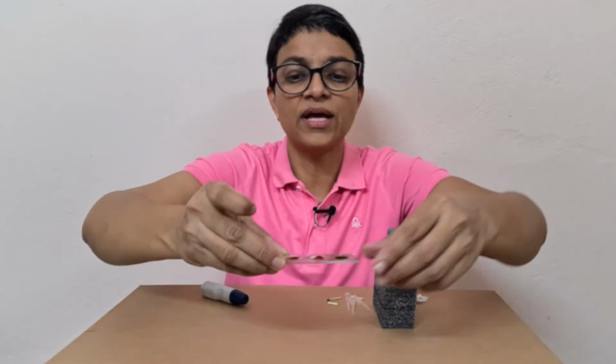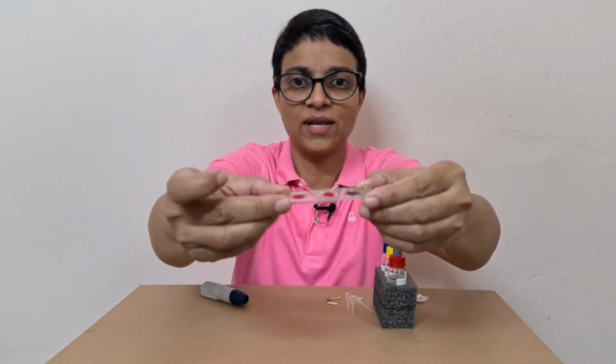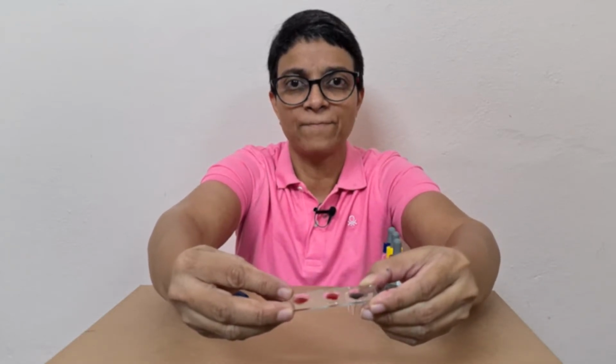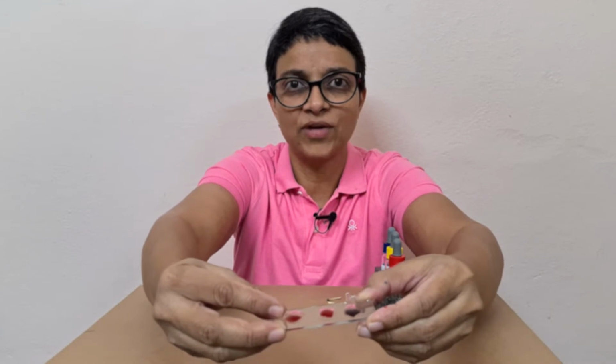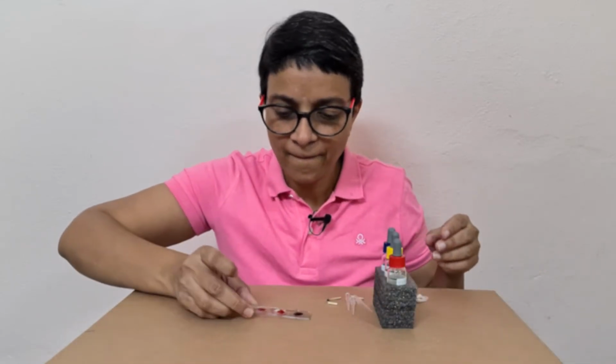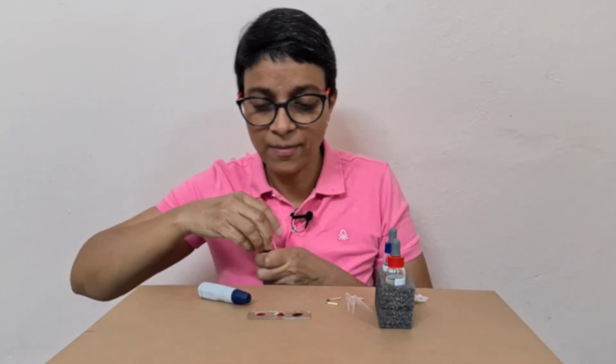You can actually see the last one pretty well, D pretty well. The clumping reaction.